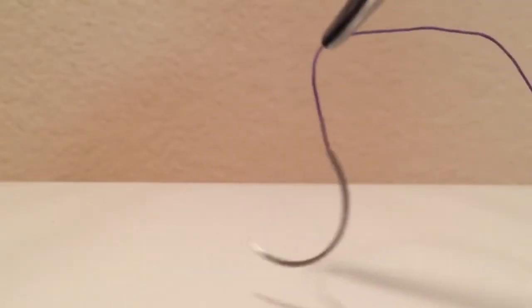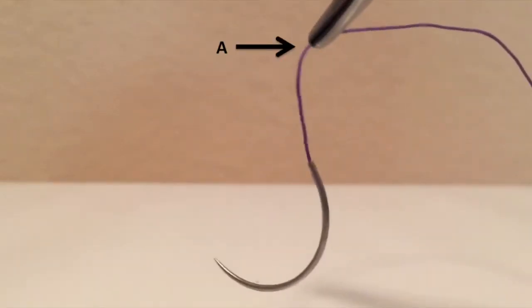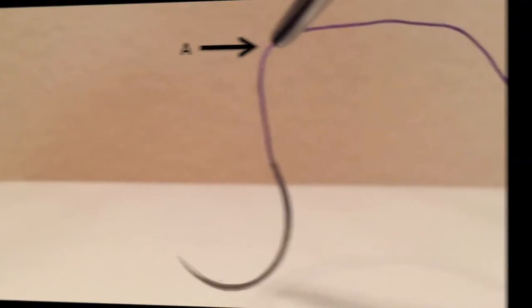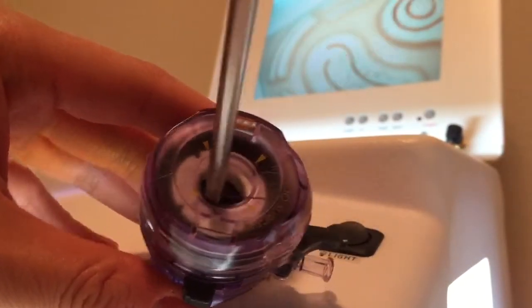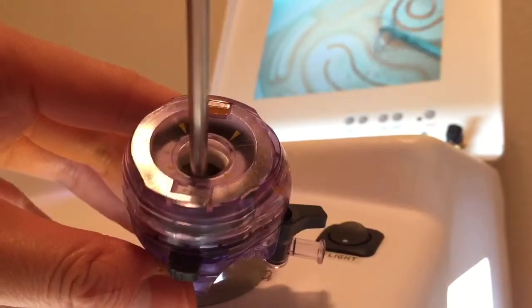Needle Entrance. First, grasp the suture at point A, about 2 cm from the needle hub. Then if you are working with a 10-12 port, you can directly insert the CT1 needle into the abdomen.